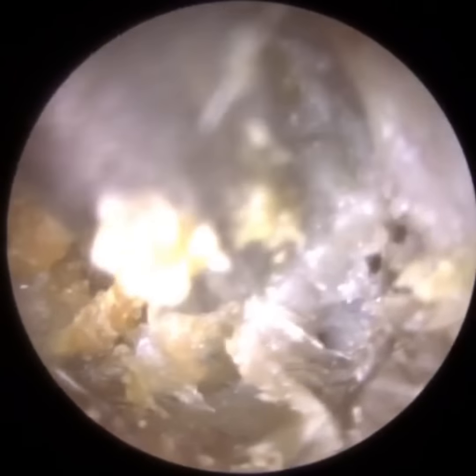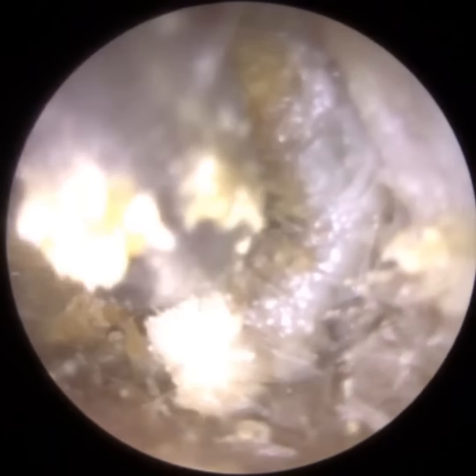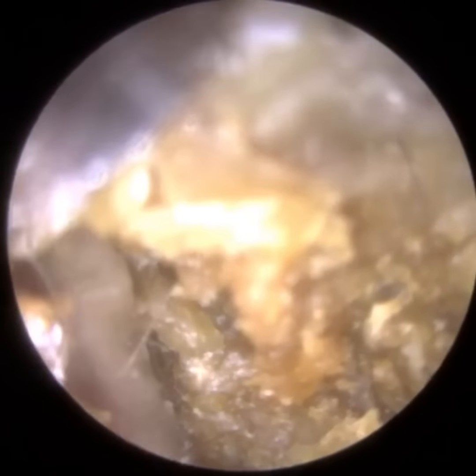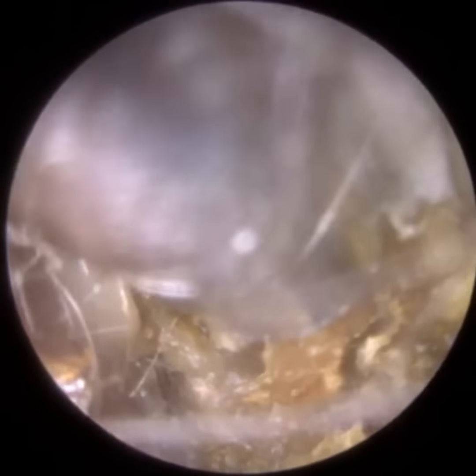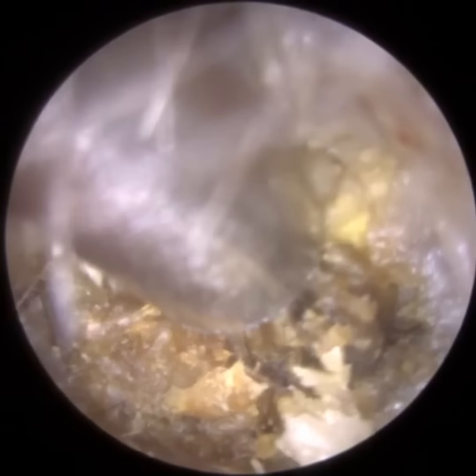And the plug has got so big that it's widened the ear canal, and it's causing what we call contact bleeding. When I'm trying to peel this and maneuver this plug off the posterior canal wall, the back part, you'll see, because the skin is so tightly adhered, there's a bit of blood seeping out. So it's nothing that we've done, we've not grazed the ear anyway. It's a hallmark of Keratosis obturans.